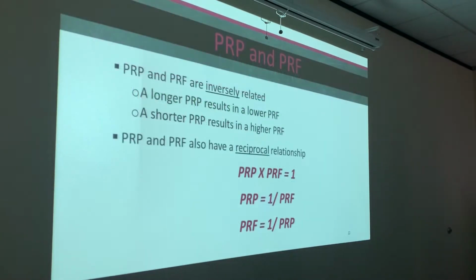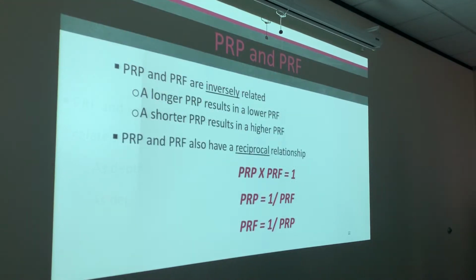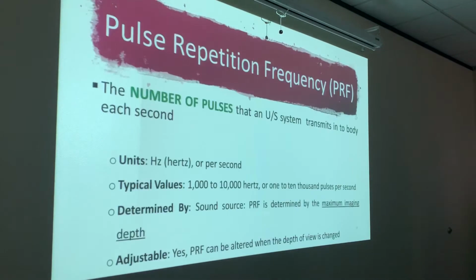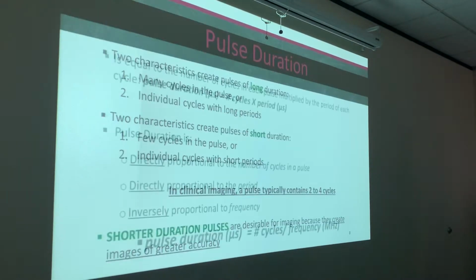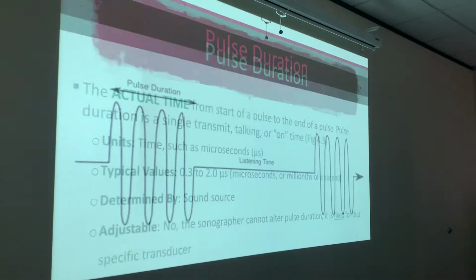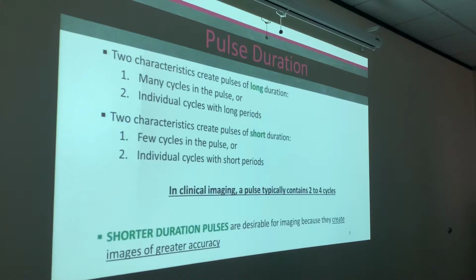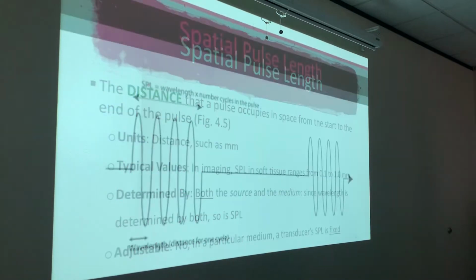Again, guys, we know that's true because we know that the ultrasound machine is always going to have to listen a lot longer than it's going to have to transmit. Remember how short our pulse duration is? Our pulse duration is 0.3 to 2.0 microseconds, or a millionth of a second. We're going to have to listen a lot longer to account for that depth that the pulse is traveling and has to reflect back.